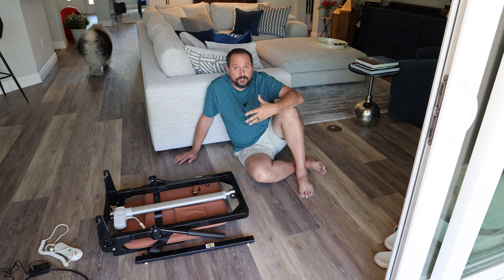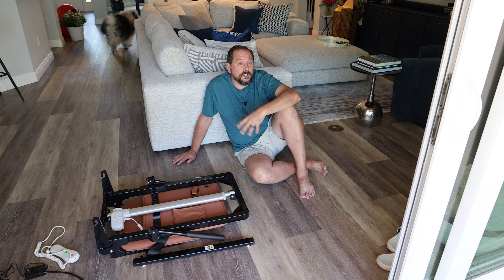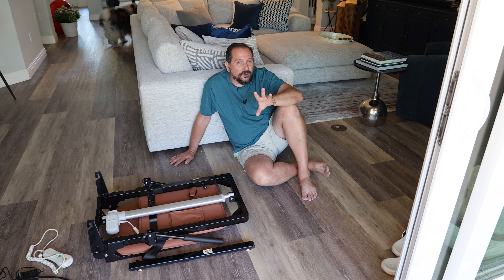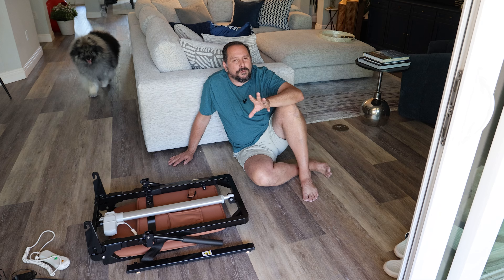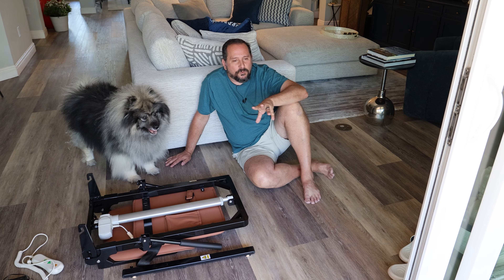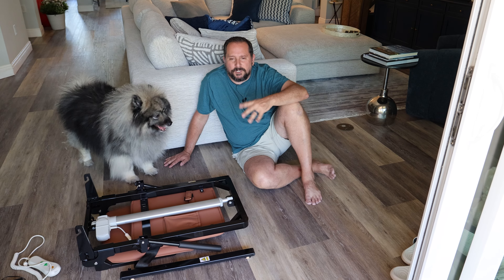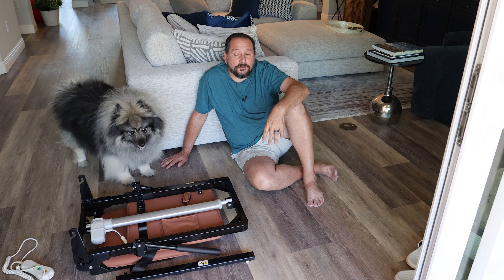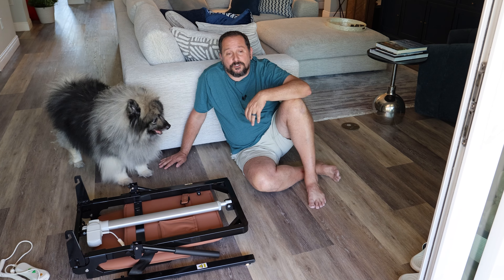This is a lifting chair which will lift you up from the ground. At this point I could still get up, but I'd definitely struggle when trying to get off the ground. I remember my grandmother — I loved her so much — she would go out in the garden and work all day, then come in and be cleaning under the kitchen, and I'd have to help her get up. This would have been an absolute game changer.